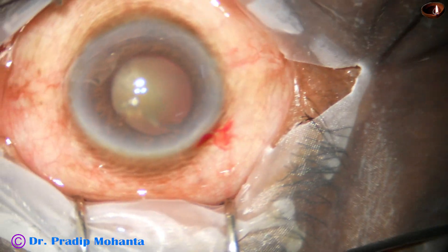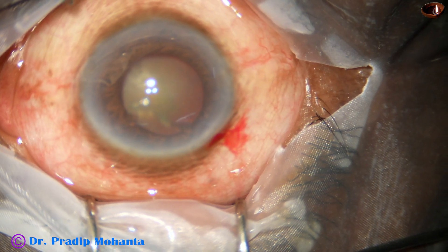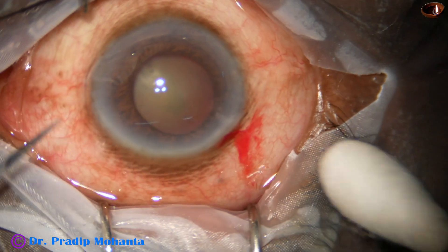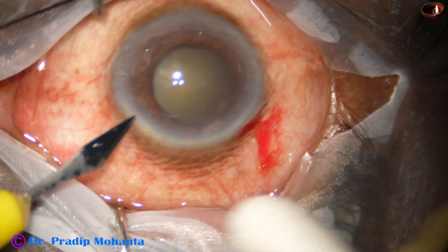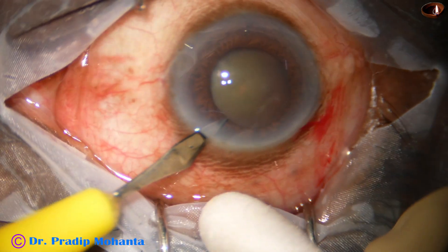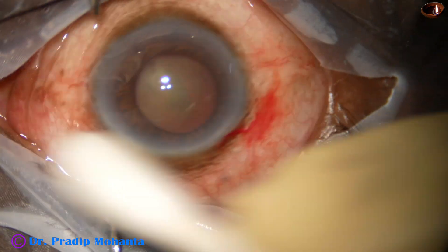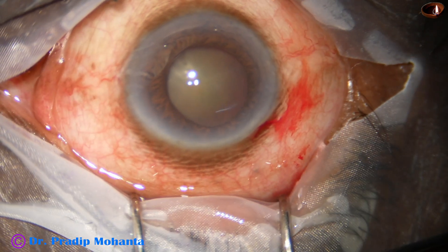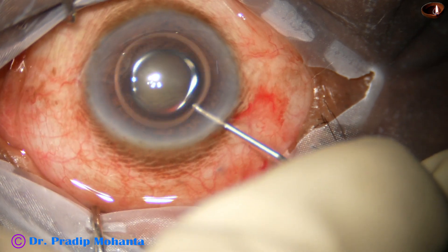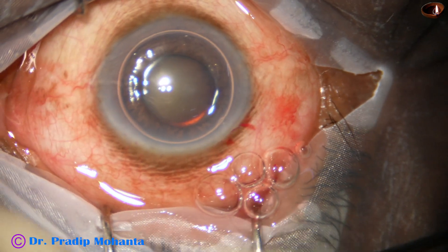I just checked if the red reflex is okay or not. It was okay, but in small pupils, in not so well dilated pupils, and with another complication like in this case weak zonules, it is always better to stain the anterior capsule with dry trypan blue dye.